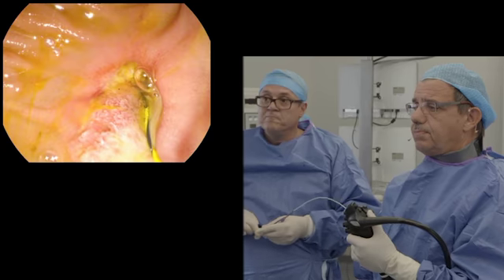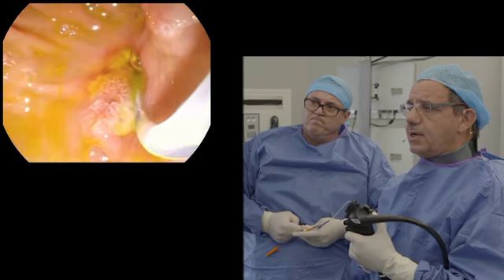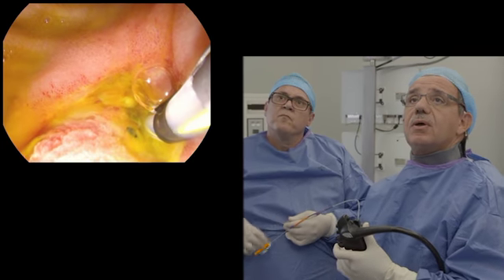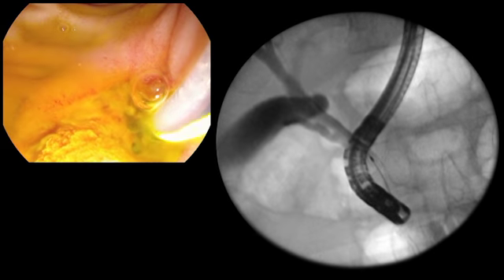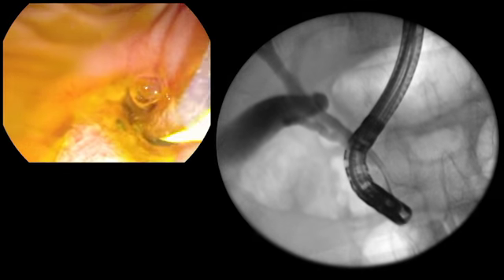A little bit traction, please, on the wire. And this is the catheter, 8.5 French catheter. You have some resistance at the level of the stenosis. Now the stenosis is passed. X-ray, please. Okay. Open the brush. Okay. And now I start brushing.